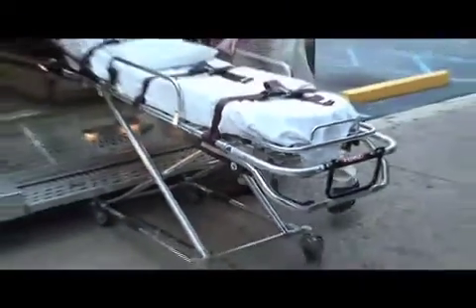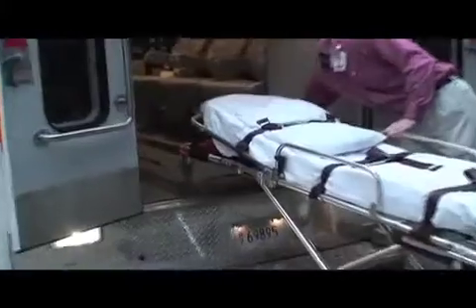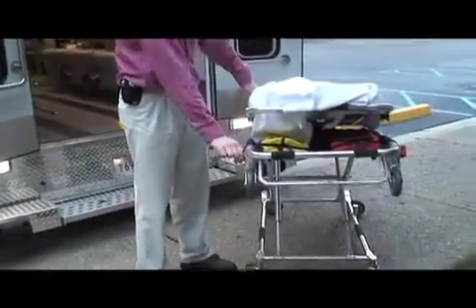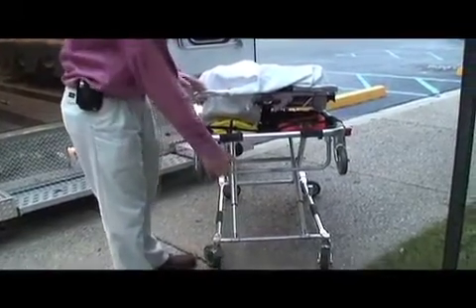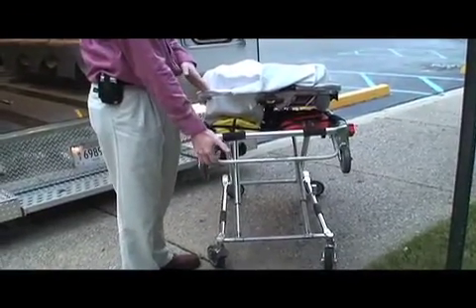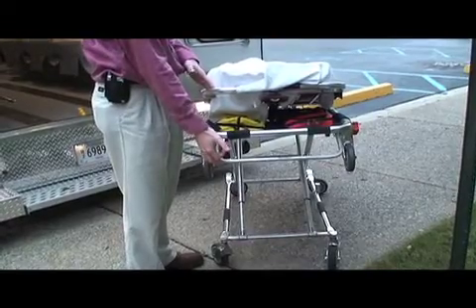Then, up at the front, there's a safety catch that catches the stretcher. You'll pull that up, and you can do that in one of two ways. There is a handle here that you can use to release the latch, or some people find it easier to just grab the bar and lift it up. Just be careful if you do that that you don't get pinched.